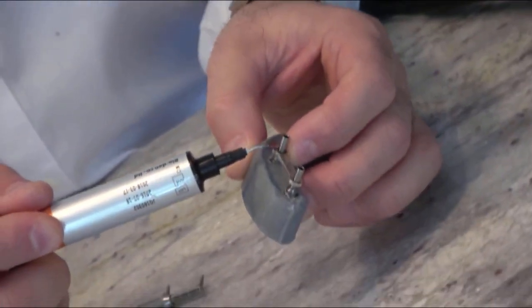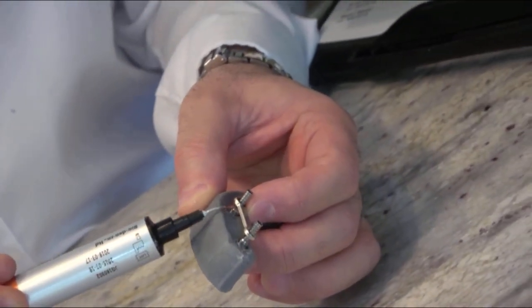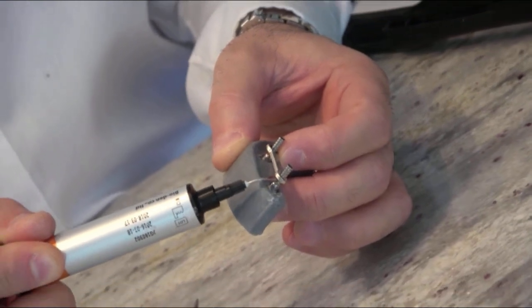Just squeeze a little bit like that, and then tuck it with light.